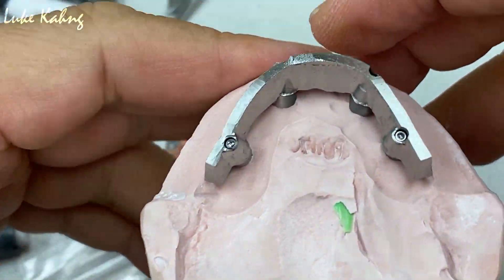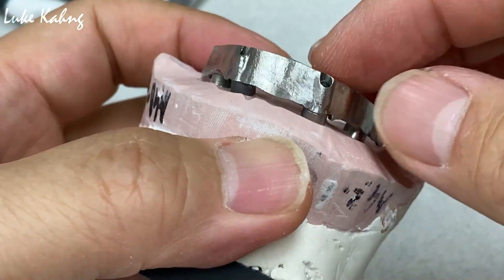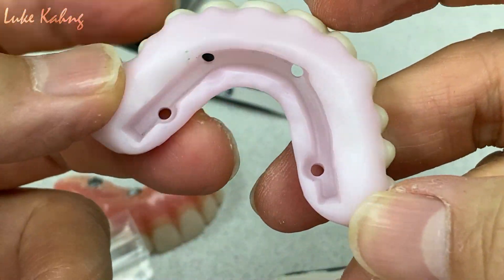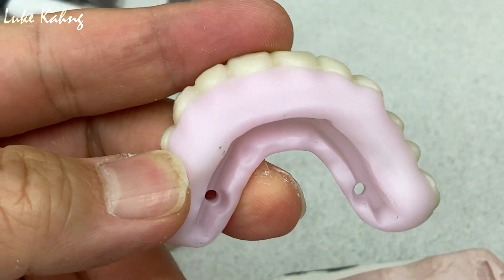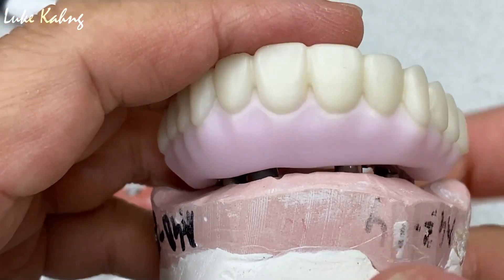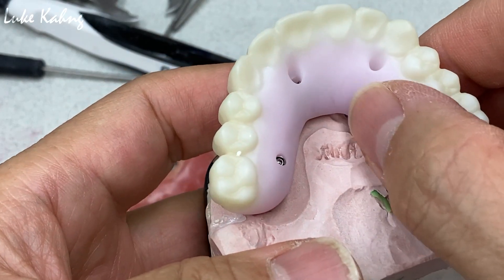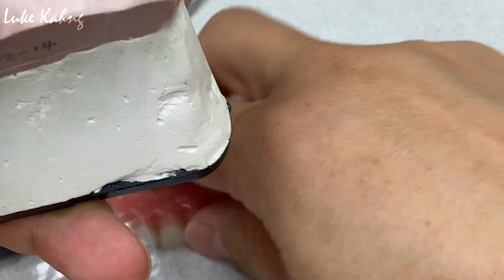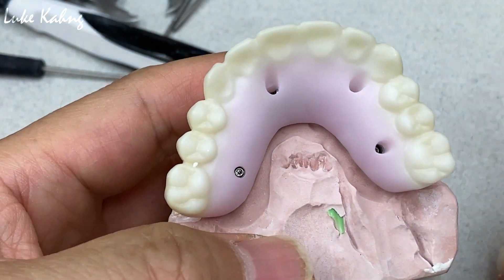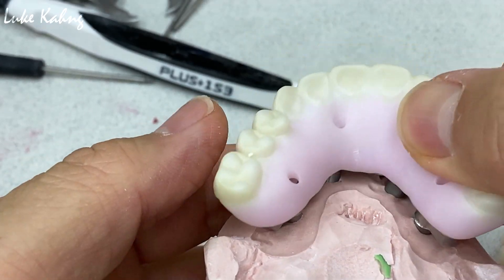This is another great option that we mill here. We made a ti-base along with a hybrid bar, and this is a specific design underneath. We can cement them together and that will never fail — the ti-base will stick together. The only thing is it is a little bit thicker, which is a downfall. But otherwise, it is never going to fail — the ti-base is not falling apart.